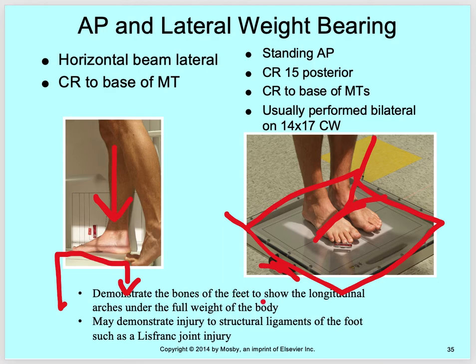So it demonstrates the bones of the feet to show the longitudinal arches under the full weight of the body. May demonstrate an injury to a structural ligament of the foot, such as a Lisfranc joint injury. So understand that you're doing AP and lateral weight bearing mostly for a Lisfranc joint injury. Okay.